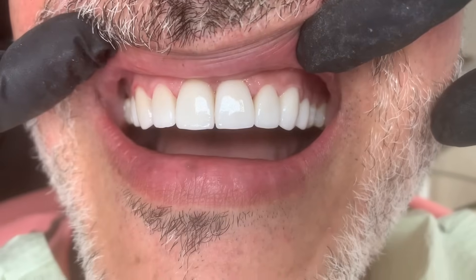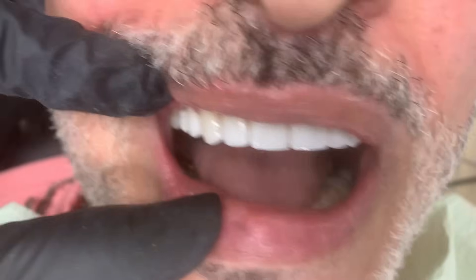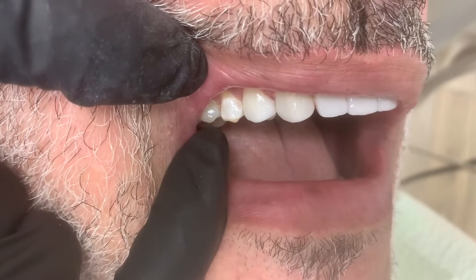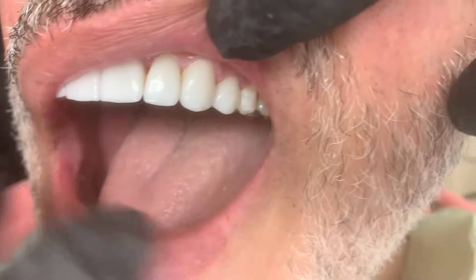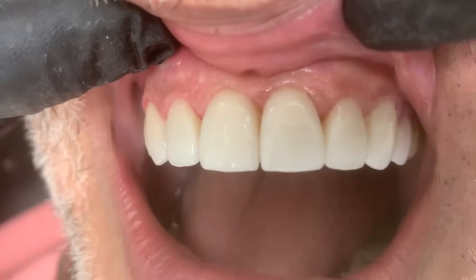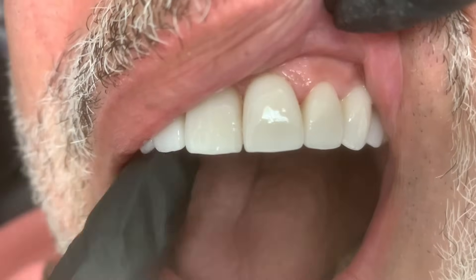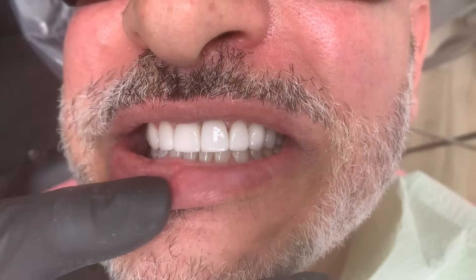Gorgeous — we did eight. Turn to the left: you can see how the bicuspid matches perfectly, even with the lighter shade. Turn to the right, all the way over to the bicuspid — check out the margins. Let's get a really close-up view. You can see how these are tucked into the gum perfectly, and again they just wrap over a little bit on the edge. Bite down, smile — they're gorgeous.